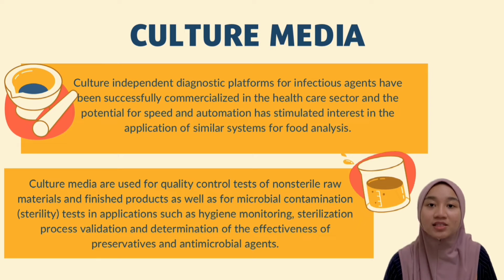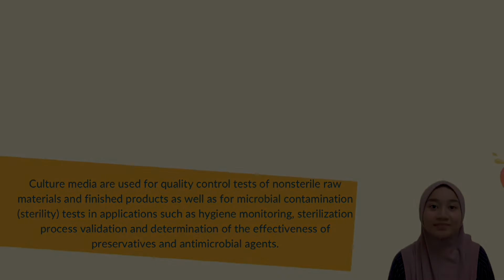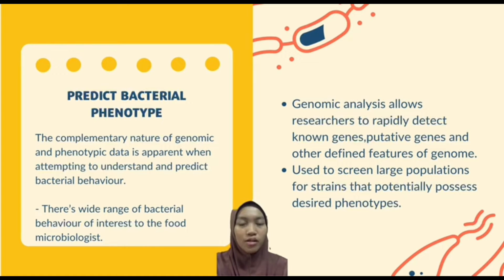Culture-independent diagnostic platforms for infectious agents have been successfully commercialized in the healthcare sector, and the potential for speed and automation has stimulated interest in the application of similar systems for food analysis. Culture media are used for quality control tests of non-sterile raw materials and finished products, as well as for microbial contamination tests in applications such as hygiene monitoring, sterilization process validation, and determination of the effectiveness of preservative and antimicrobial agents. Next is about predicting the bacterial phenotype.